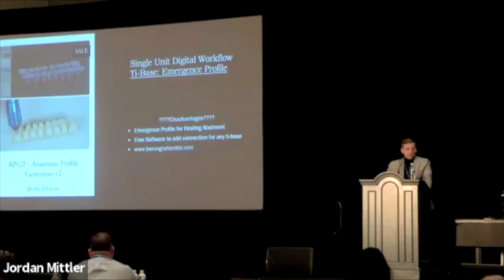Okay. So this is a really interesting program. It's called Anatomic Profile Generator. This is a free program that you can download from Baron Gruder DDS. This comes with 4 designs per quadrant. So you have molar, premolar, canine, and anterior for each quadrant. And with this program, you download this, and you can input the digital library for whatever tie base that you want, and that will put the insertion piece into it. So you can print as many of these as you want, and just keep some tie bases stocked, put it into there, and have unlimited, very nice anatomic healing abutments ready to go.